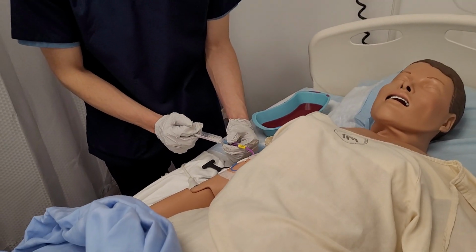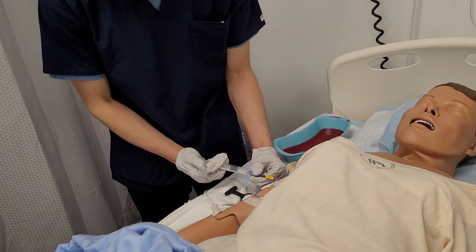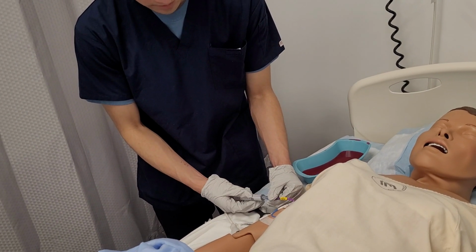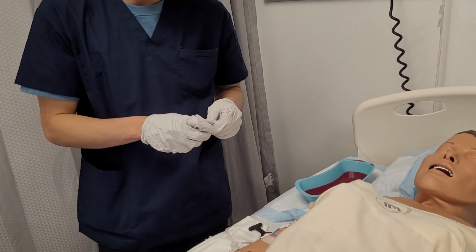Then I'm going to proceed to the push-pause method, making sure I don't bottom out the syringe. There we go.